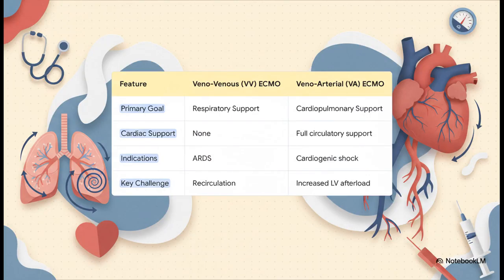With VV ECMO, the patient's heart absolutely must be working. We're not helping the pump, we're just handling the gas exchange. The biggest technical headache we face here is recirculation. That's when the freshly oxygenated blood we just returned gets immediately sucked right back into the circuit. Now, VA ECMO is a different beast. It provides that full hemodynamic support, but this creates a huge new problem. By pumping backwards into the aorta, we dramatically crank up the afterload on the left ventricle. Managing that LV is one of the most critical tasks for us as anesthesiologists.